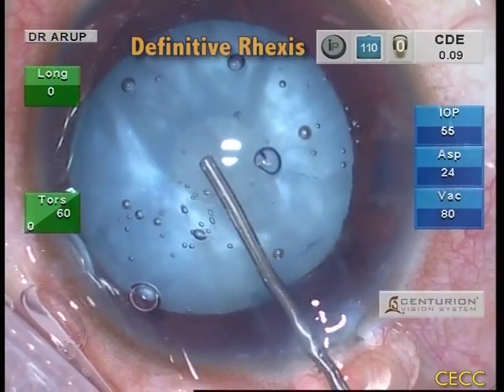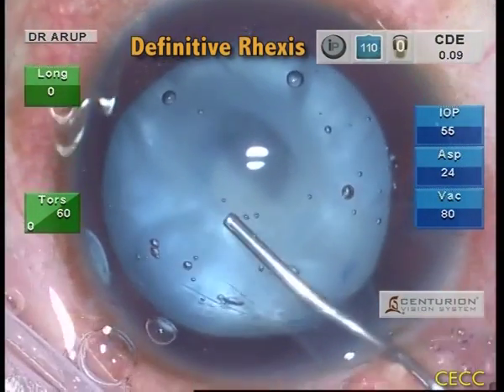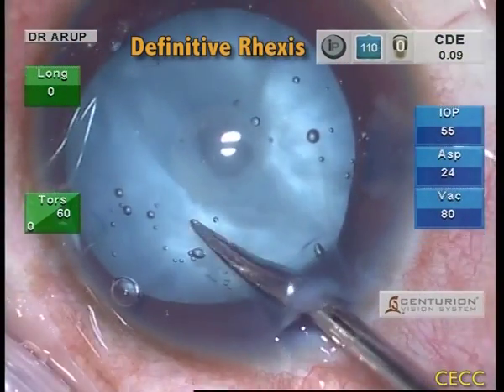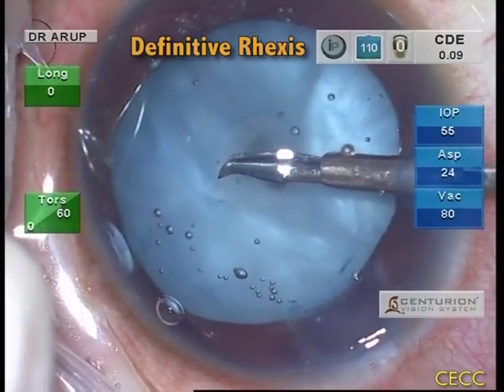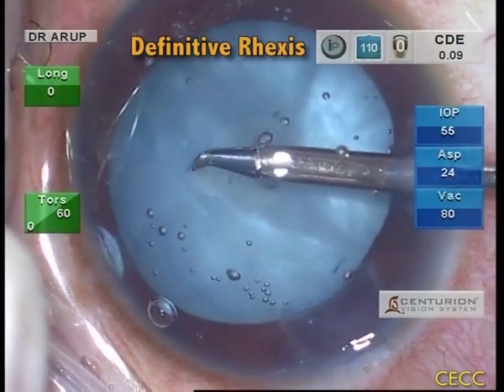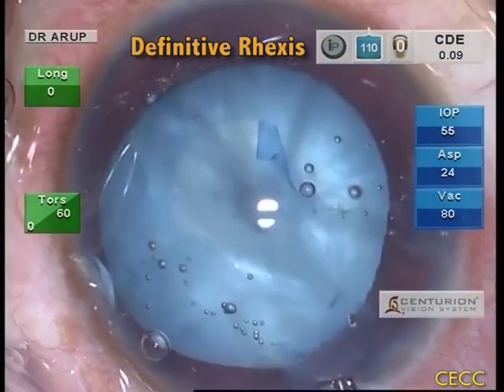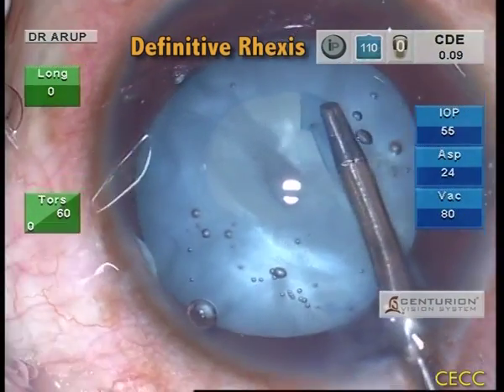Prior to making a definitive RHEXIS, the anterior chamber is filled with sodium hyaluronate 1.4%. The RHEXIS margin is nicked with the micro-RHEXIS scissors. With the help of micro-RHEXIS forceps, a definitive RHEXIS of the desired size is accomplished. It may be necessary to maneuver the instrument from the side port as well as the main incision until a complete RHEXIS is obtained.